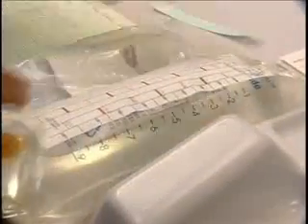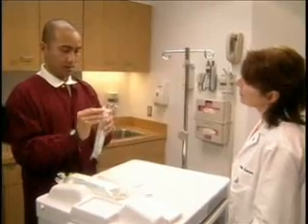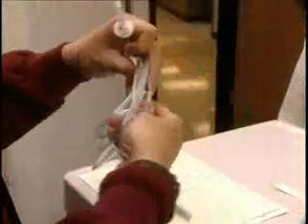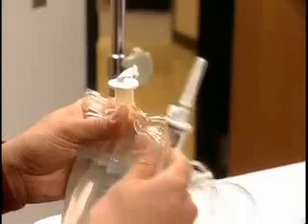Okay, now the solution bag is all set. Now for the tubing. I'll just take the new administration set from the package and clamp the tube. Okay, and carefully remove the protective cover seal at the entry port of the new infusion container. And be very careful not to touch the port to keep it sterile.